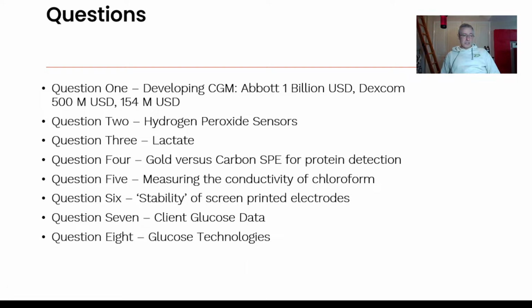Glucose technologies, the polyurethane barrier layer will last for years. Just keep it in an air-conditioned dark room. The glucose oxidase solutions, it does say -20, and that really helps. So it'll last several months because basically it's frozen. And also glucose oxidase itself is quite a robust enzyme.